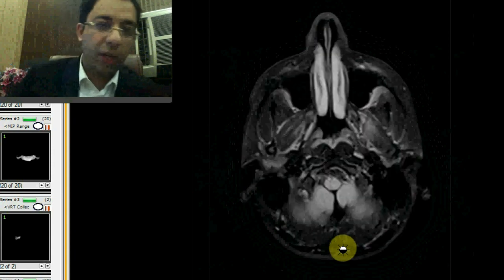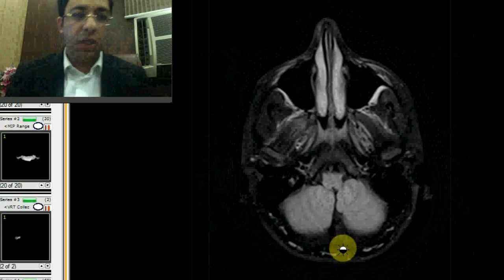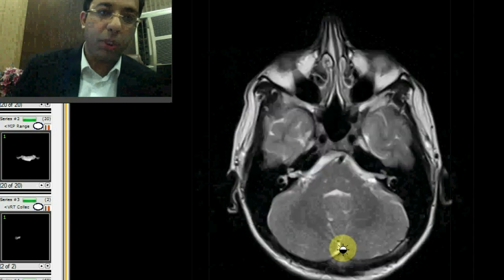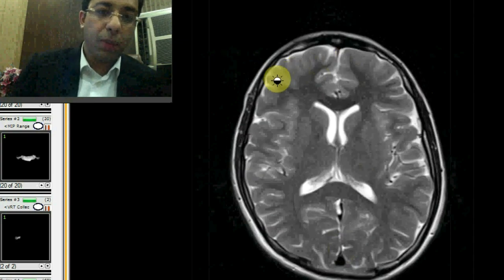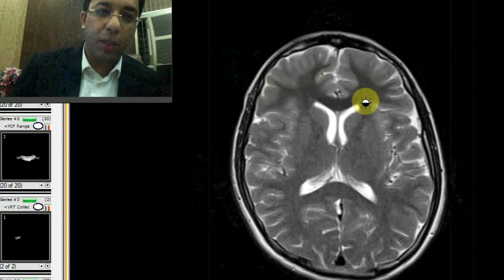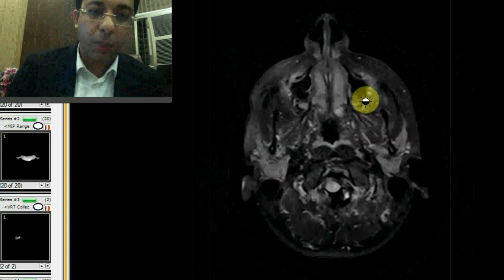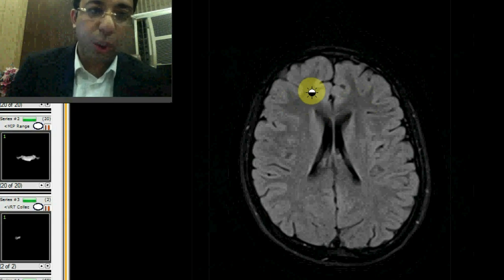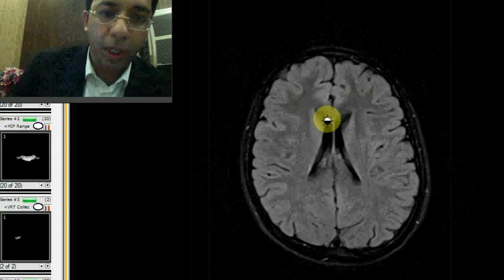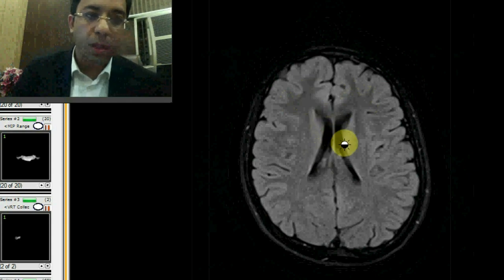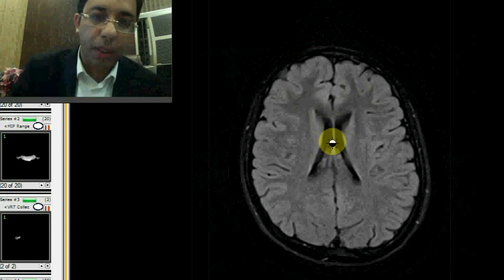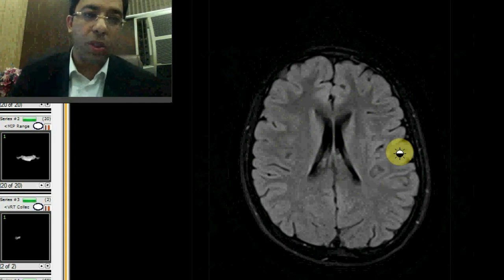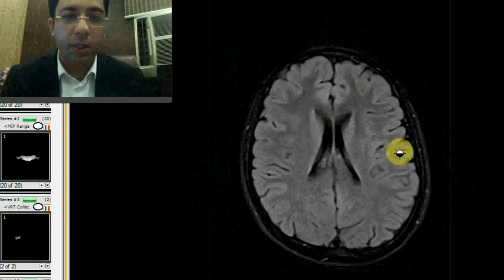Now, what is FLAIR? FLAIR stands for Fluid Attenuated Inversion Recovery sequence. On a T2 weighted image, gray matter looks white while white matter appears dark. FLAIR is essentially a T2 weighted image in which the CSF signal has been suppressed — water signal becomes black. If there is any edema, it would appear as a bright area. We do FLAIR to look for pathologies or edema in the brain.